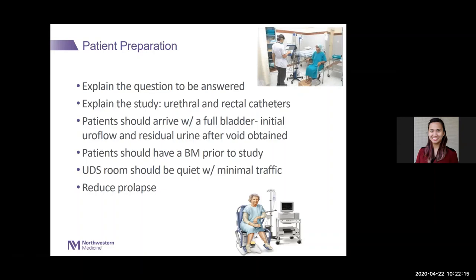But it's nice to have them void when they first get there to do an initial uroflow. Why? Because that uroflow is probably going to be a little better than the one with the catheter in. Not always, but it can be. And then you can measure their residual urine after they go. So when you place the catheter, the first thing we do is drain the bladder and measure what the residual urine is.